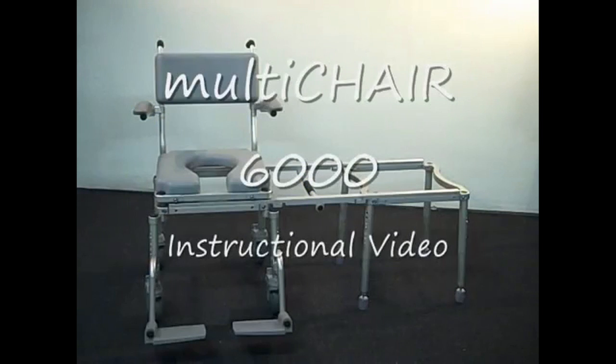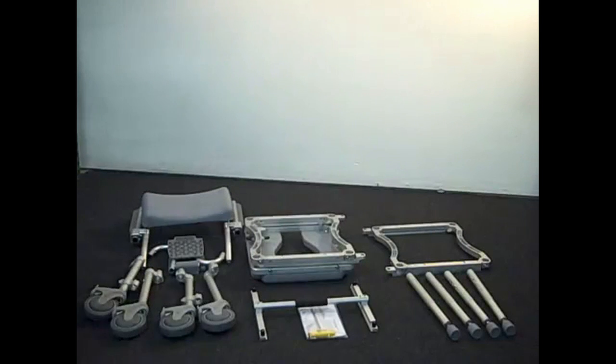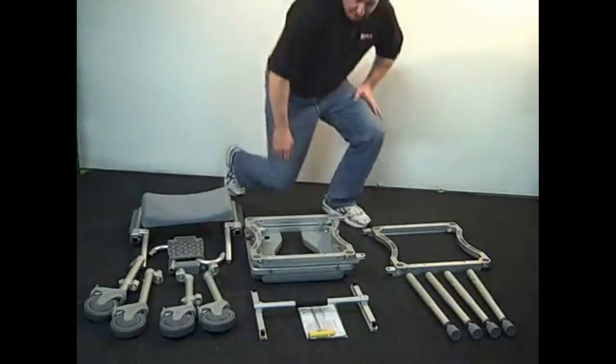The following is an instructional video which explains how to assemble the Multi-Chair 6000 slider system. After you receive your slider, unpack the parts and lay them out.